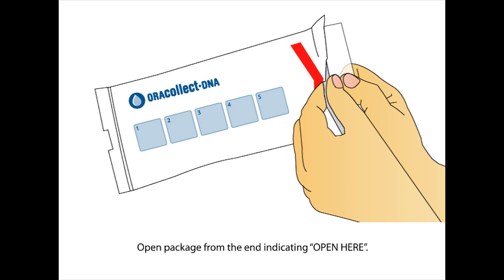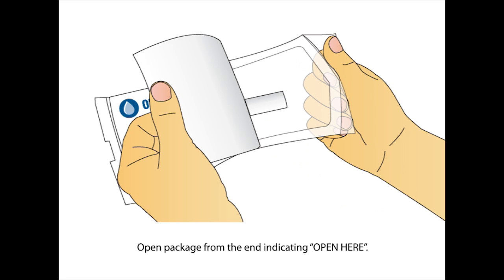Open the package from the end with the 'open here' arrow. Remove the collector by its handle from the packaging.